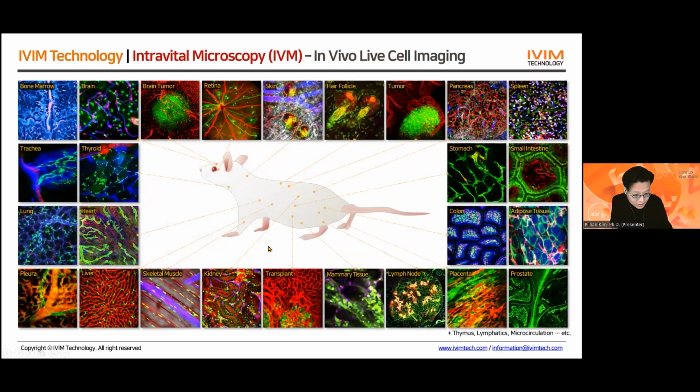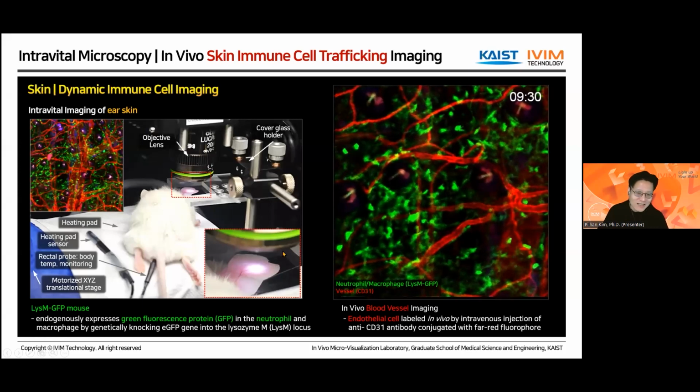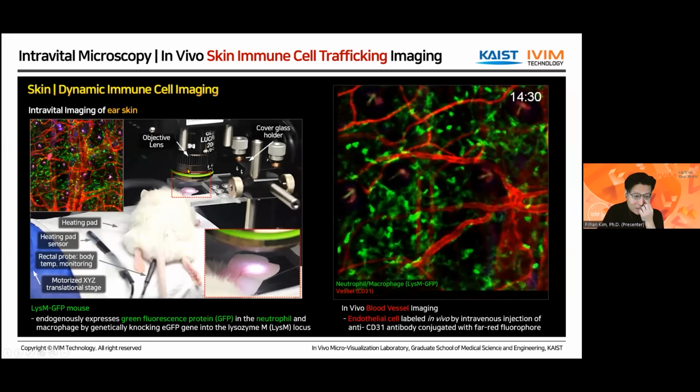Okay, so now, I already spent more than 30 minutes. So from now on, I just briefly show how we image all these different organs in a live mouse model. So yeah, this is one example of skin. So this is ear skin imaging.